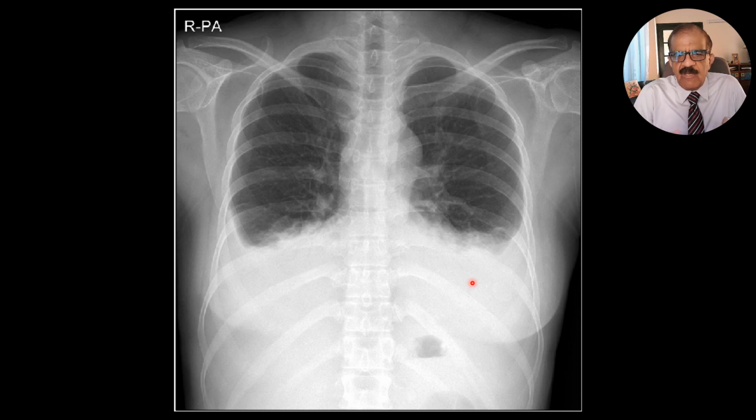So this covers our X-ray part, but I told you there is another technique of picking up pleural effusion, and that is ultrasound. Ultrasound has come up as a very useful investigation. It has a relatively limited application on the chest, but one of them is detection of small pleural effusion, and also detection of encysted effusion, and also finding the exact point where you should put your needle if you want to tap it. That way you will cause minimum trauma to the patient, because you will go straight to the floor. So let's see what an ultrasound can show in the case of pleural effusion.